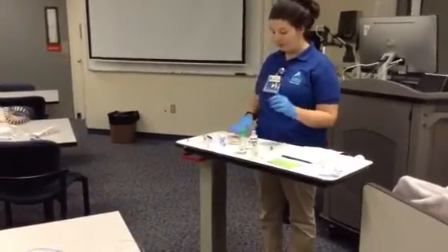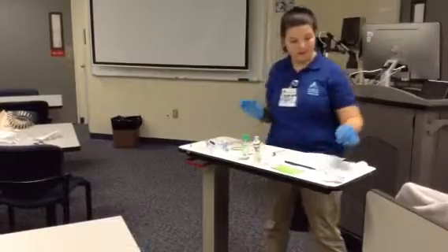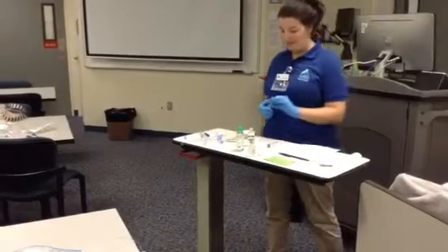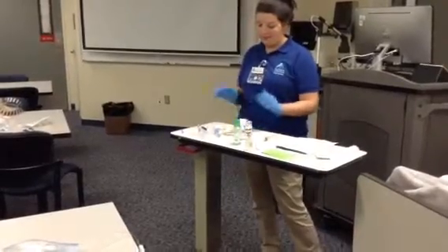Okay, now I've got my medication in the bag. I'm going to mix it up a little bit. Alright, and at this point I would put my label on the bag, which is the client's name, the drug, the dosage, the time, and my initials. Alrighty. Now that's ready to go.